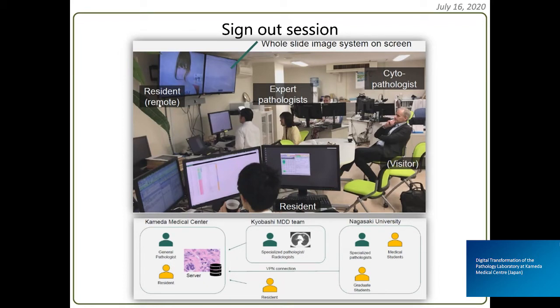So once again, this setup for education is interesting. It offers not only a teaching session, but at the same time, we have several expert pathologists reviewing the same case, and they put in two signatures, let's say, or three signatures under a difficult diagnosis. That means we are simultaneously making a double-checked and validated diagnosis. It's also a kind of quality assurance.